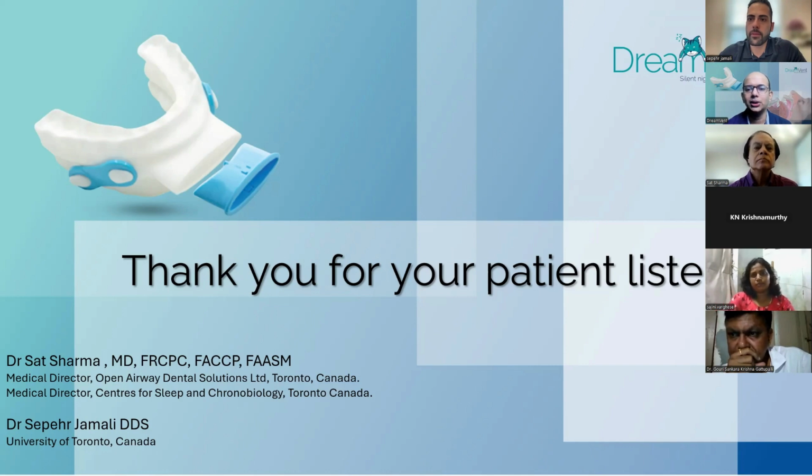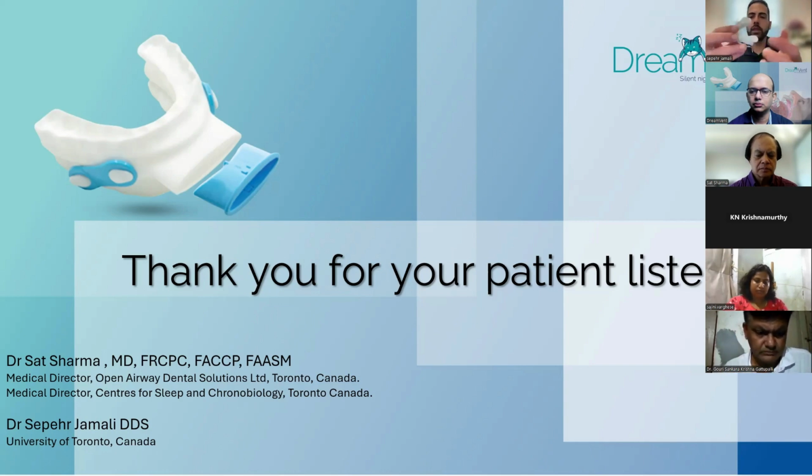Okay, another question is, what if the patient is wearing removable dentures? Yeah, so that's the difficult part. It depends on the classification. If it's a removable partial denture that's tooth-bound, like a Kennedy class 3, where they have only a few teeth missing, I have had some patients like that. Even if they are missing one or two teeth and they're wearing an RPD, definitely there's no issue for that.